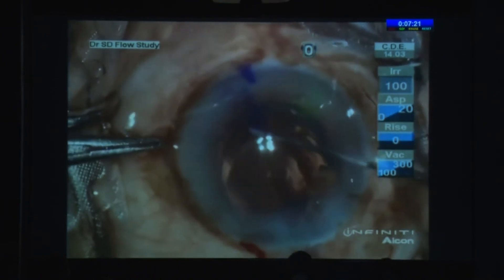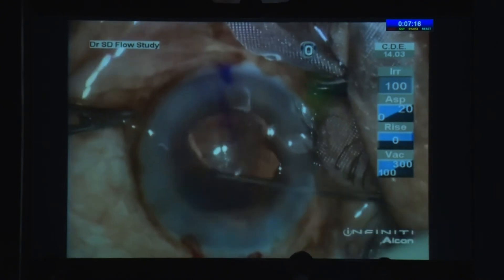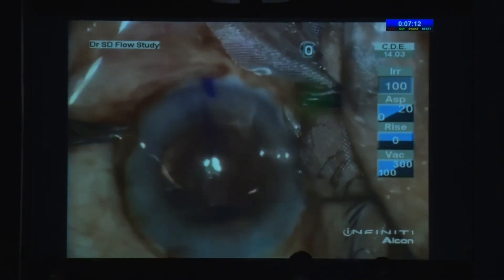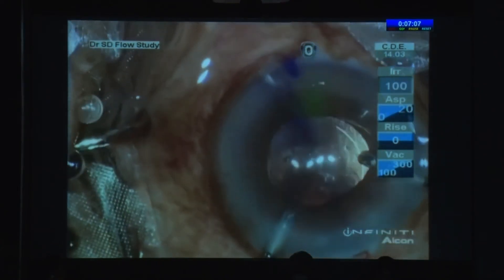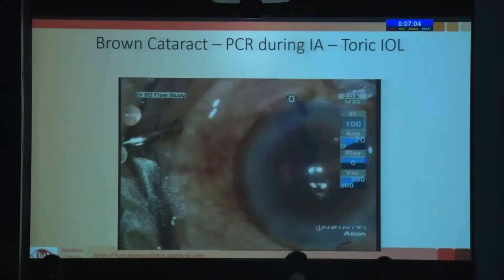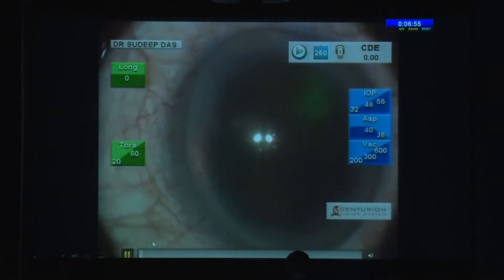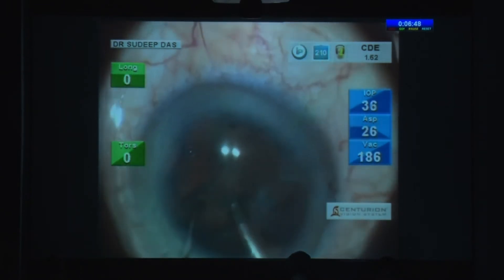There wasn't much cortex left at that stage. It's not always possible to convert the PCR into a rexis — if there's a small flap you can do it, otherwise it doesn't work. But most of the time the tear is stable. I could actually implant the IOL in axis because of the small central tear. The lesson is: do not polish the posterior capsule during PPC — we teach our fellows this, but don't always follow it ourselves.